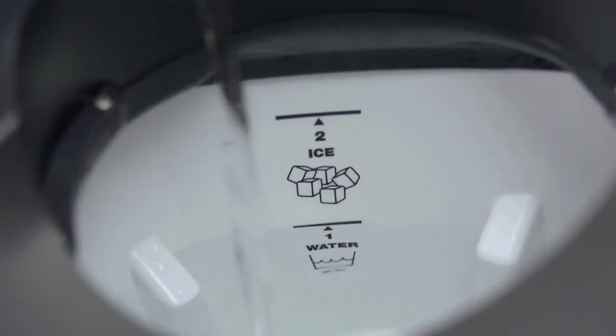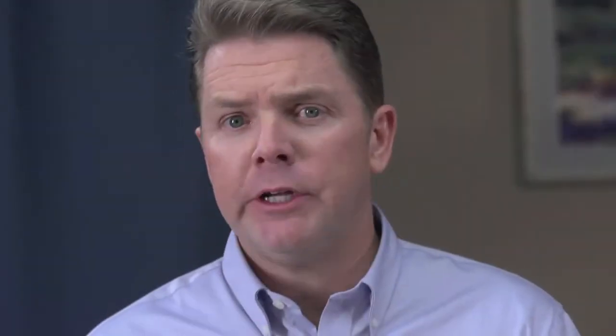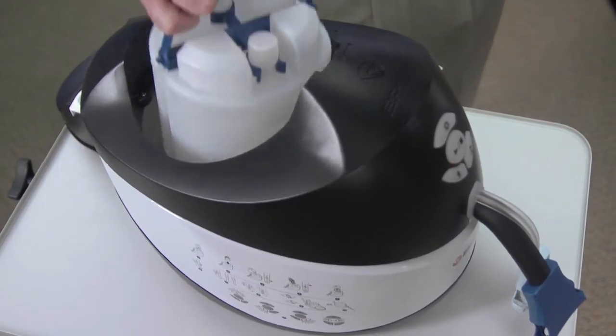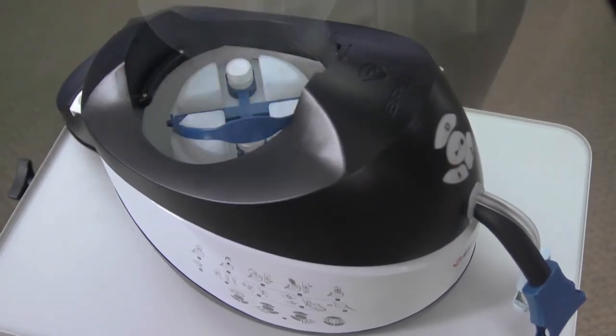You have the option to add frozen water bottles, ice cubes, or a combination of both. If using water bottles, freeze for a minimum of six hours and then place into the container. If using ice cubes, fill to the ice fill line inside the container.